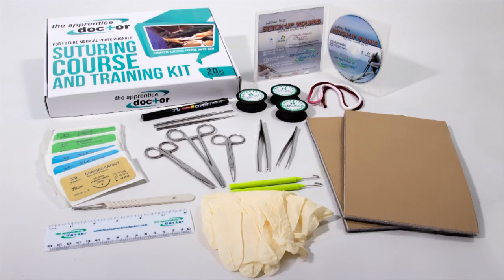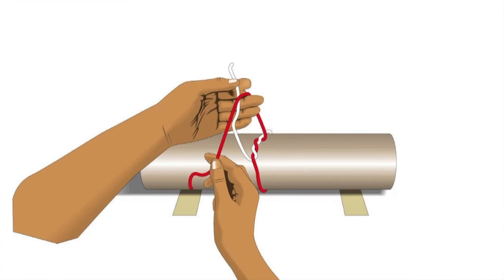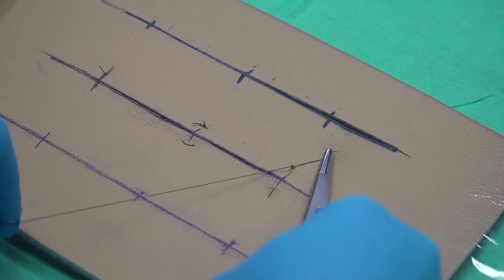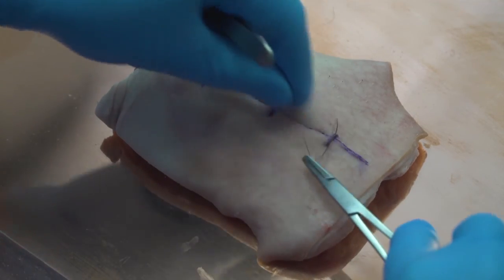Use the Apprentice Doctor Suturing Course and Kit to gain suturing skills in the following steps. Step 1: Learn how to tie the various types of surgical knots. Step 2: Learn and practice the various suturing techniques using the artificial skin supplied in the kit. Step 3: Practice your new suturing skills using a suitable cut from your butcher.